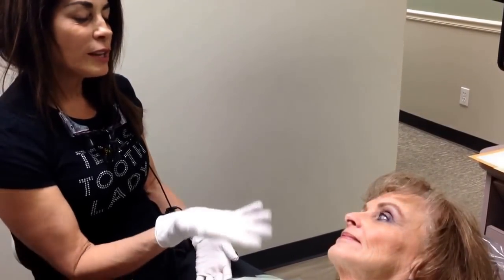Tell me why you chose Snap-on Smile. Well, I had a front tooth that broke, and it was repaired three times, and it just wasn't going to hold, so I chose this to get it fixed. And instead of going with veneers, I didn't want my teeth ground down, so I chose this instead.